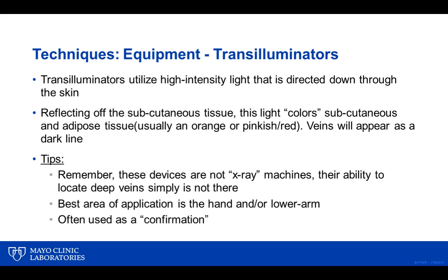For the individual that is having that brain-finger argument, saying, there's one, and your brain is going, I'm not so sure, then one of these handheld transilluminators can help with that confirmation. The best area of application for any of these devices is the hand and/or lower arm. And again, as I already stated, often these are used more as a confirmation of what you may have already felt.